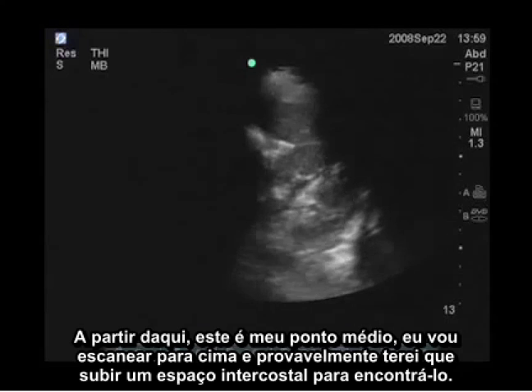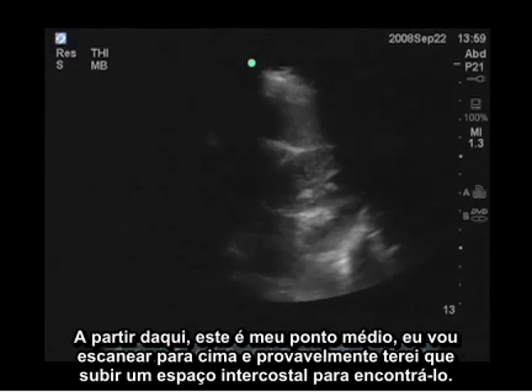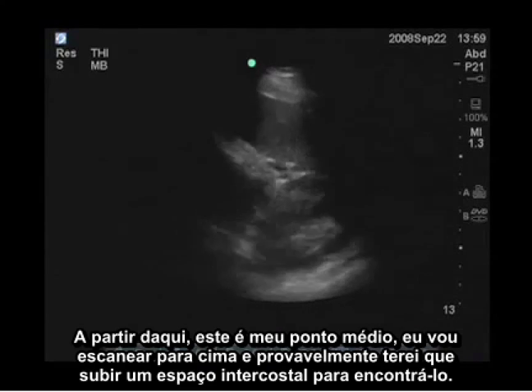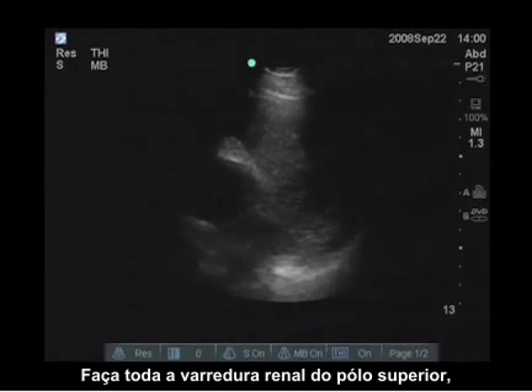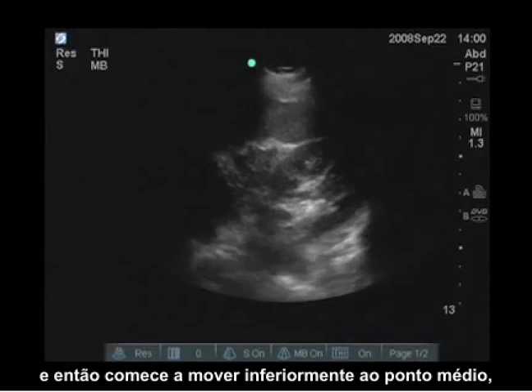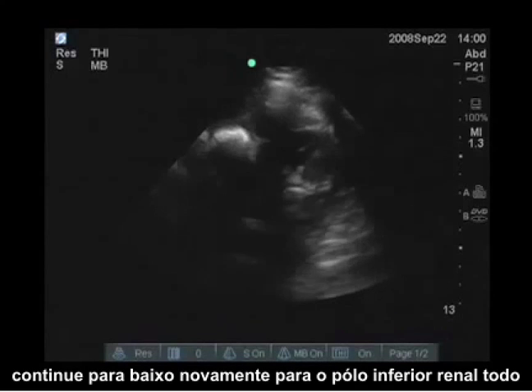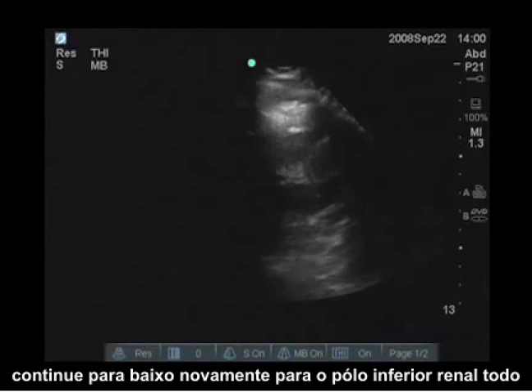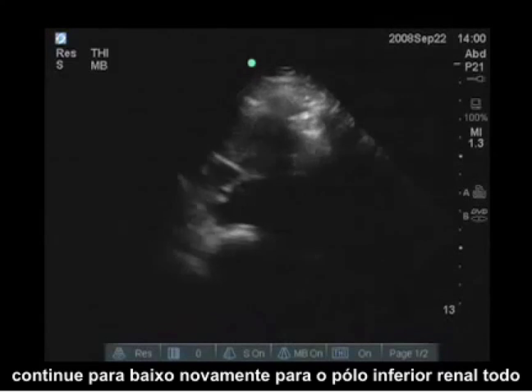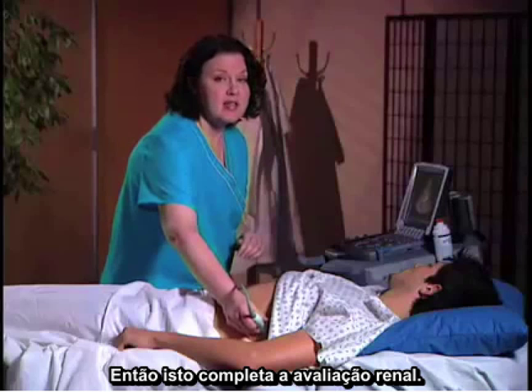From here, this is my midpoint, and I'm going to sweep superior. I might have to go up a rib space to find it. Go all the way through the kidney, through the superior pole, and then start to move inferiorly to mid-level, continue on down, inferior again, to the lower pole of the kidney, and all the way out. That completes the kidney evaluation.